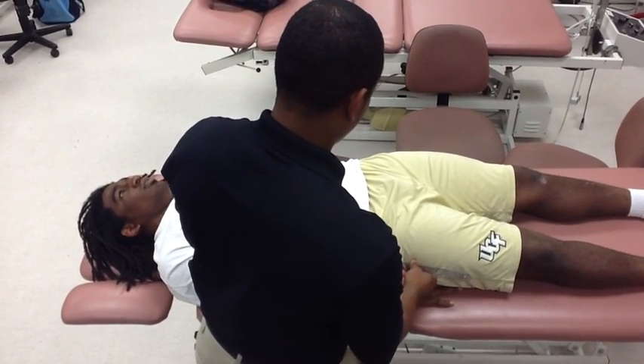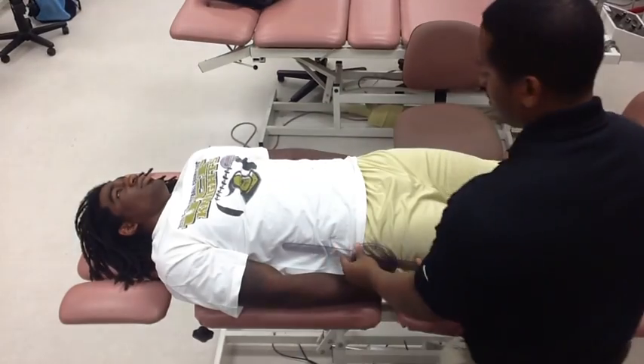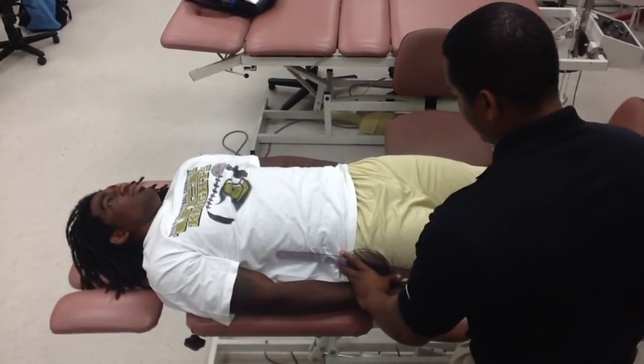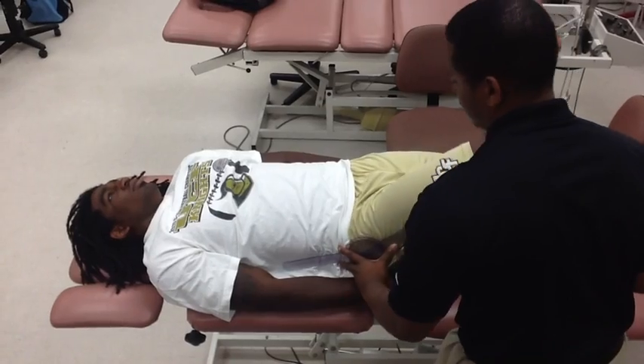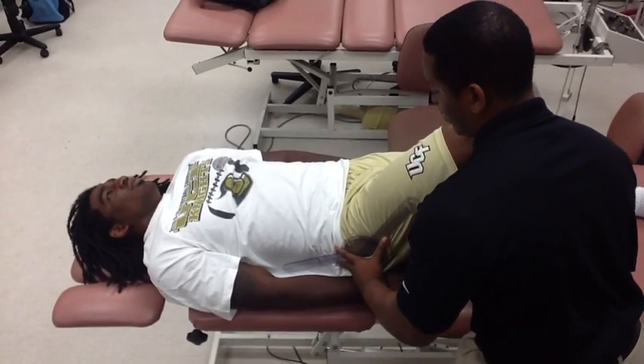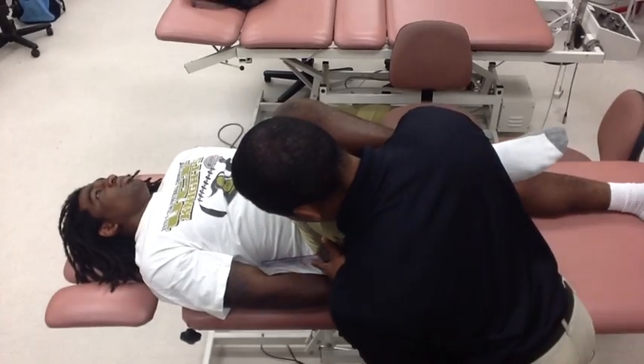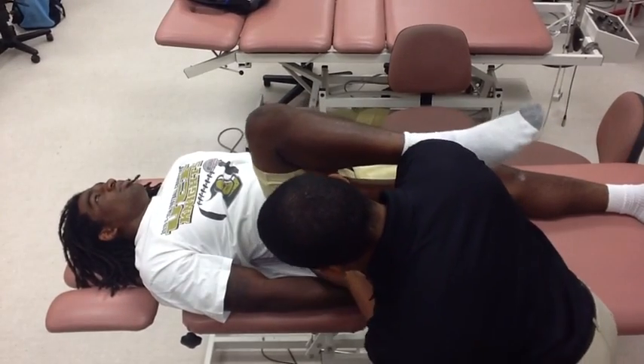The stationary arm will be lined up in the middle of the lateral side of the trunk. And the movable arm will be lined up on the lateral side of the femur pointing towards the lateral condyle of the femur. Next, place your hand on the posterior distal part of the femur and push the hip into flexion. Make sure to keep the goniometer lined up.